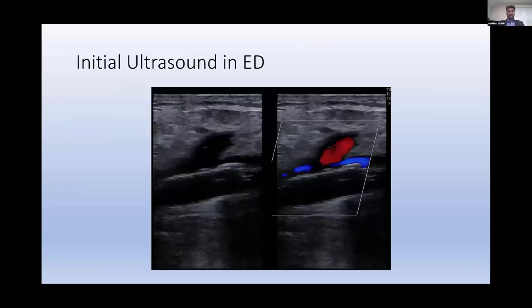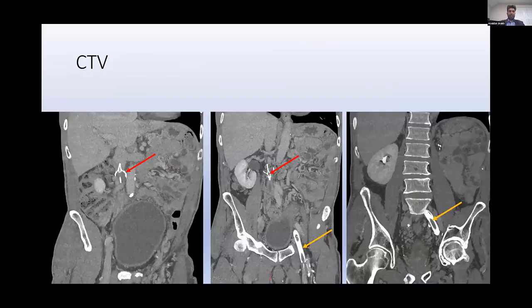I was sitting in the reading room reading studies one evening — this is how I learned about this patient. Ultrasound was done, and the common femoral vein was noted to be stented without any flow, but there was flow in the GSV. I recommended a CT venogram, which was done. These are three sequential coronal images going left to right from anterior to posterior.